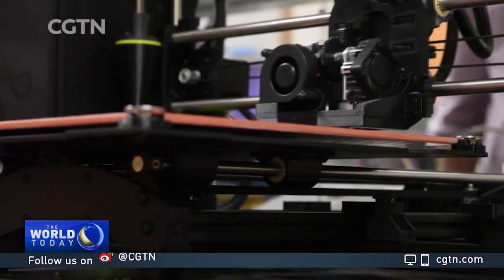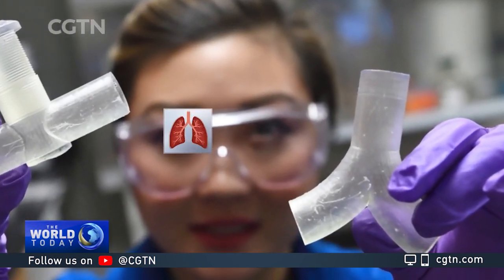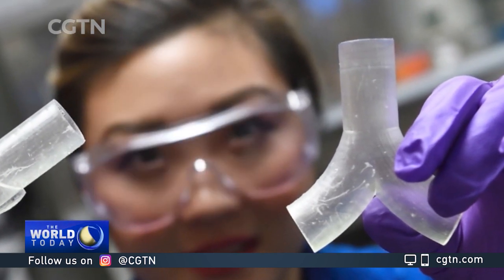Sun Hoong Kang, assistant professor of mechanical engineering, is leading the team. Right now, we want to first start with about 2 patients, but then we think that we might be able to extend to up to 4 patients. The splitter is 3D printed with unique features. One is its branch-like shape, designed to mimic the pathways inside our lungs, which splits the air to different patients.